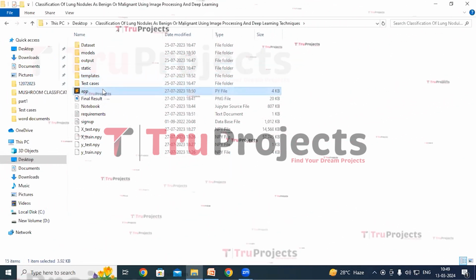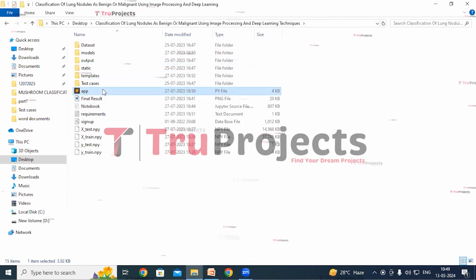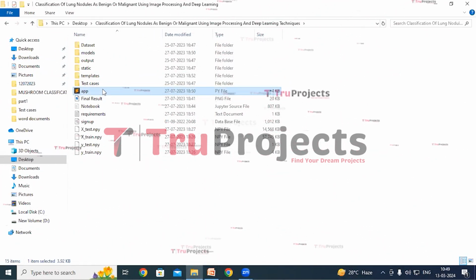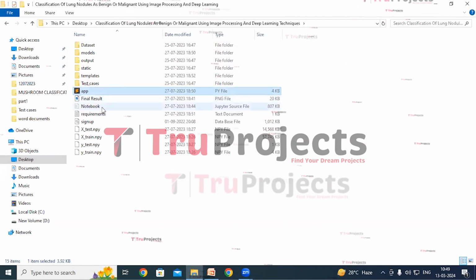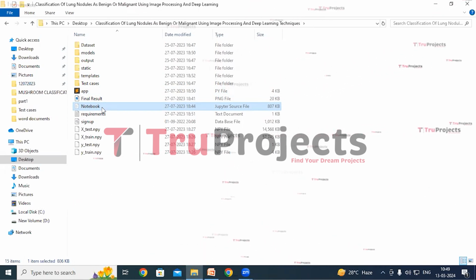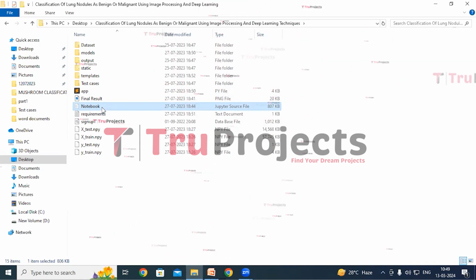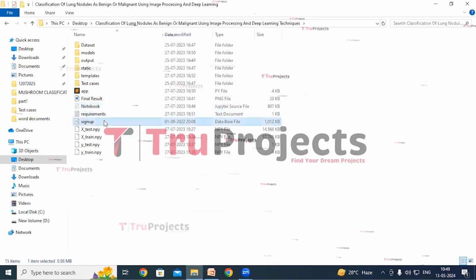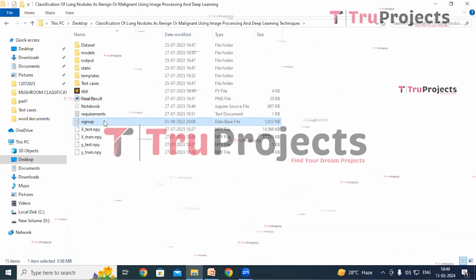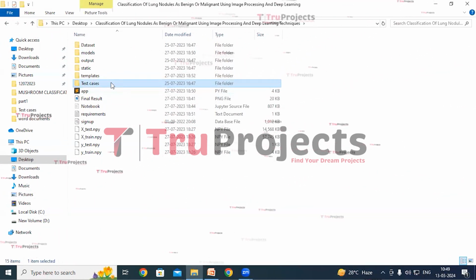This is app.py file. This .py file contains the information related to front-end logic. It includes code written in Python that handles server-side operations such as processing user requests, interacting with the database, and generating dynamic content to be rendered in the HTML pages. This is Notebook Jupyter source file which contains a combination of code, graphs, and outputs all in one place. It allows users to write and execute code in individual cells, making it a popular choice for data science. This is signup.db file. This file is the database file used to store user information. And this is test cases folder in which I have test images on which will make the classifications.